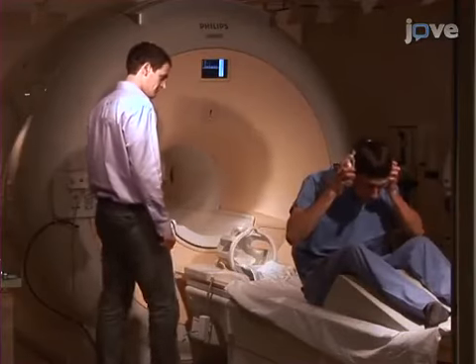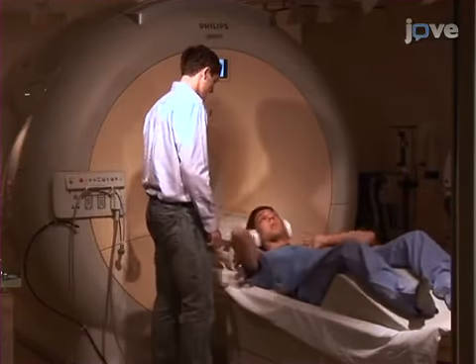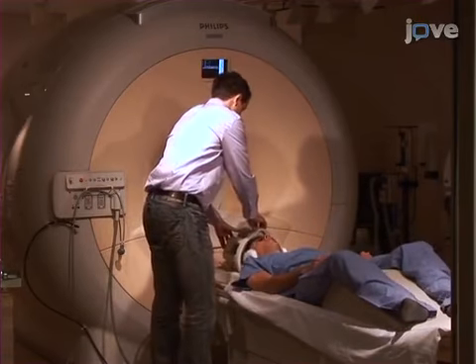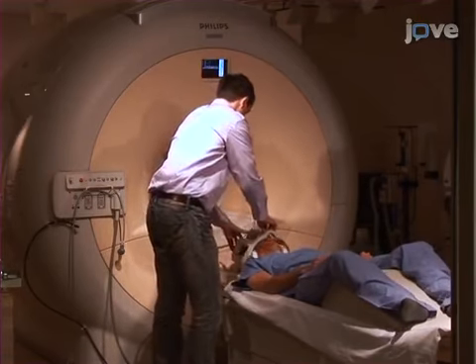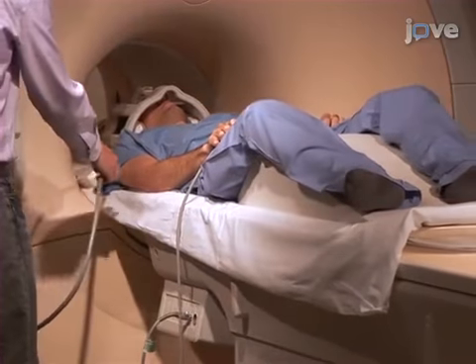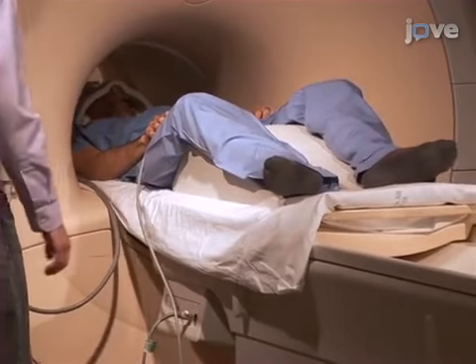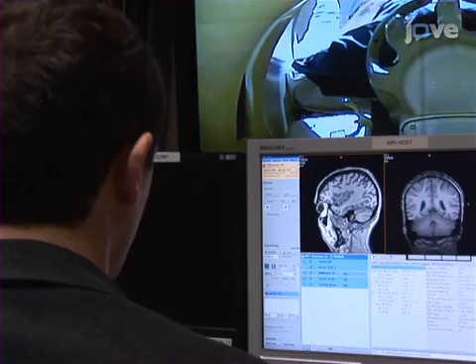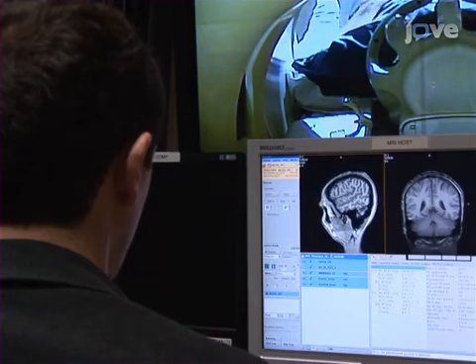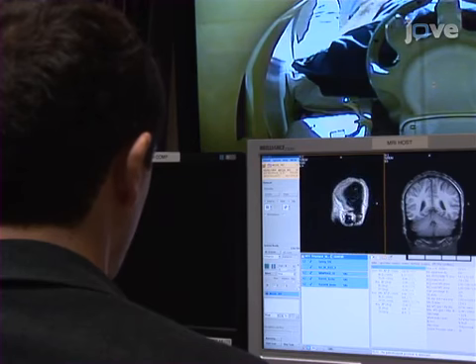Begin this protocol by obtaining structural MR images of the subject. First, acquire a structural MR scan using a magnetization-prepared rapid gradient echo, or MP-rage, or similar sequence. This sequence may take 5 to 10 minutes depending on the specific scanning resolution and imaging protocol used.